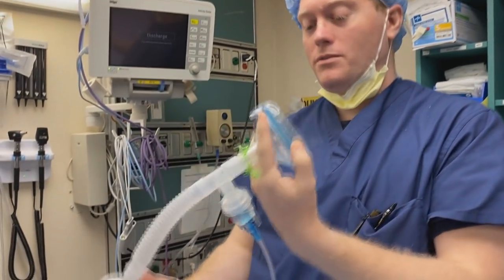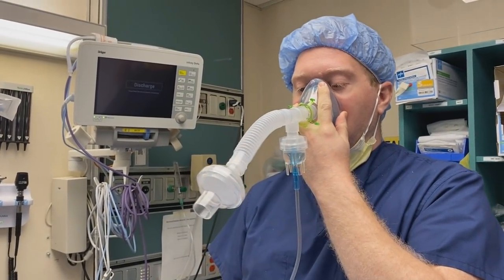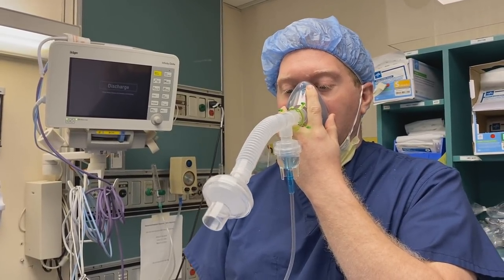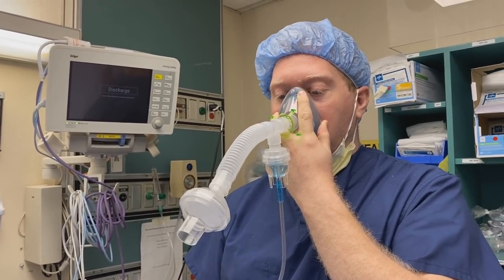I do think this will cut down significantly the amount of aerosol that goes out into the atmosphere from the patient. As the patient's breathing in and out, the main thing is you just have to keep that mask on the patient.